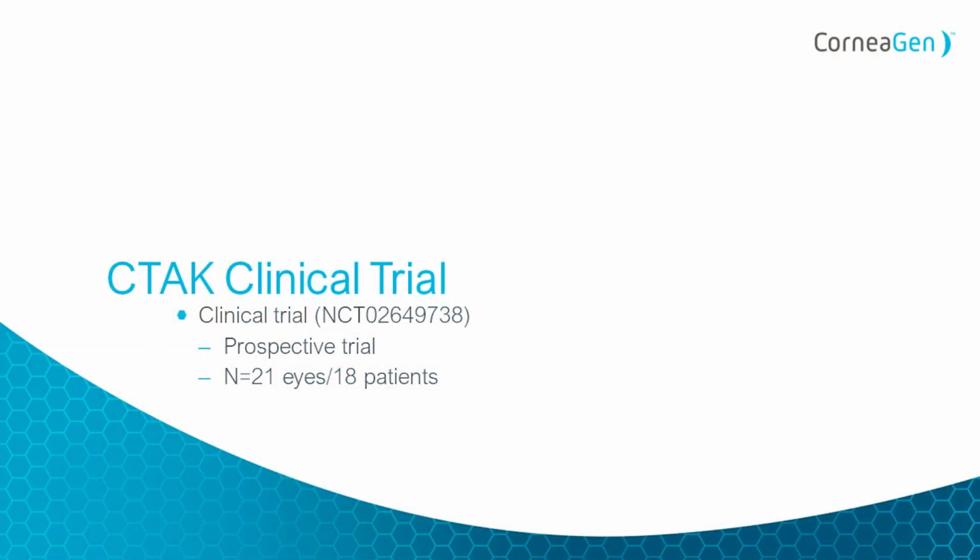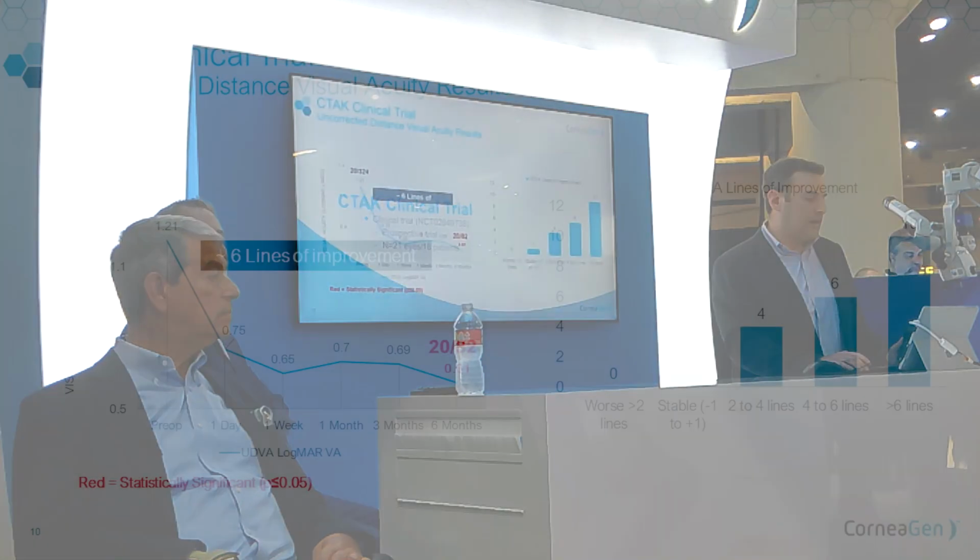Steve? Thank you. So now that we know that CTAK is a very customized inlay, we went through the software that will customize it, the customization of the placement. So the key is now to see whether all of that actually works. And so we did a prospective clinical trial on 21 eyes of 18 patients. We're now past 60 eyes that we've placed this version of the CTAK segment in, with the results being very similar to this first 21.